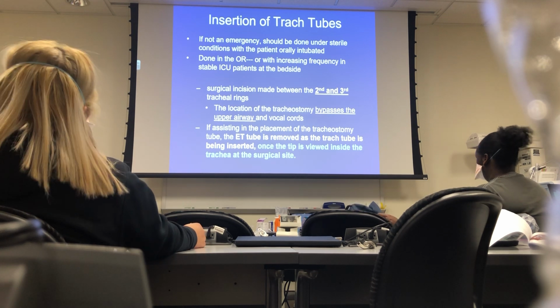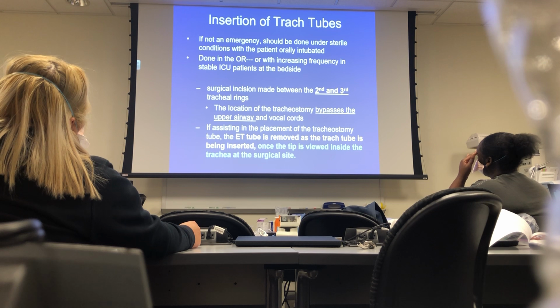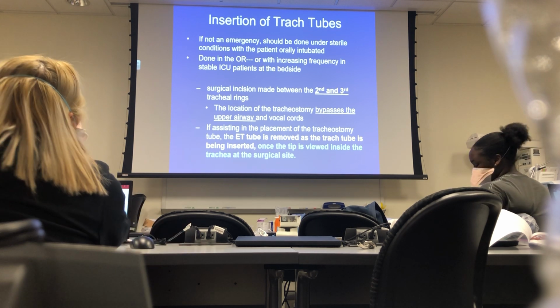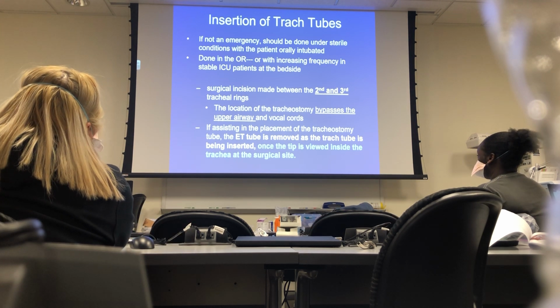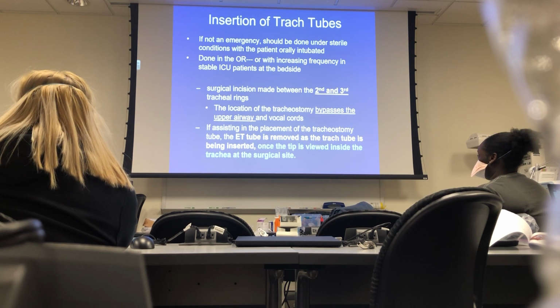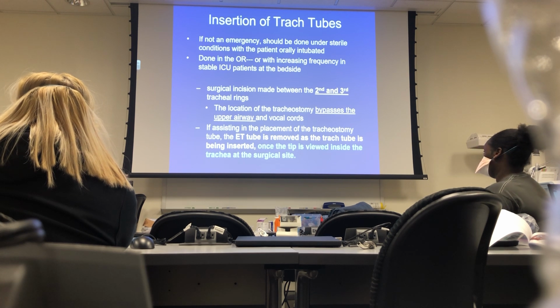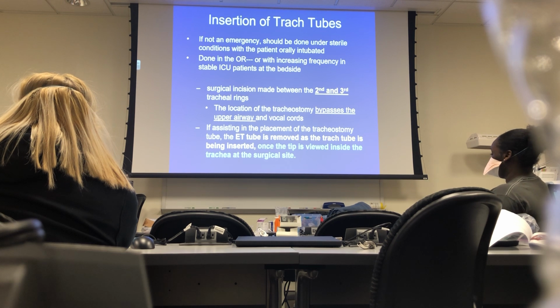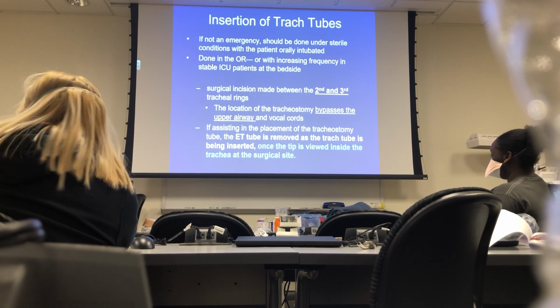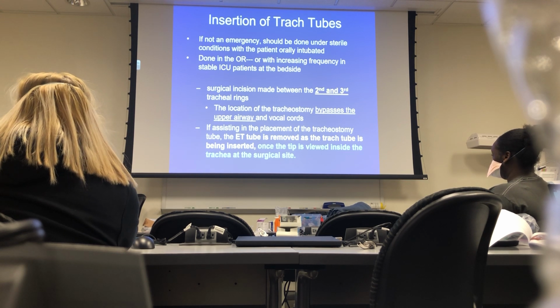Okay, so what do you need to know here with insertion? They're put in between the second and third tracheal rings, okay? They can be done in the OR under sterile conditions or at the bedside. You guys won't be in the OR when somebody gets a trach, but now they're doing a lot of trachs at bedside. They're called percutaneous trachs. I'll teach you more about that in trends, but that is put in a little differently than in the OR when they cut and dissect the trachea. They don't quite do it the same, all right? But the entrance is between the second and third tracheal rings.